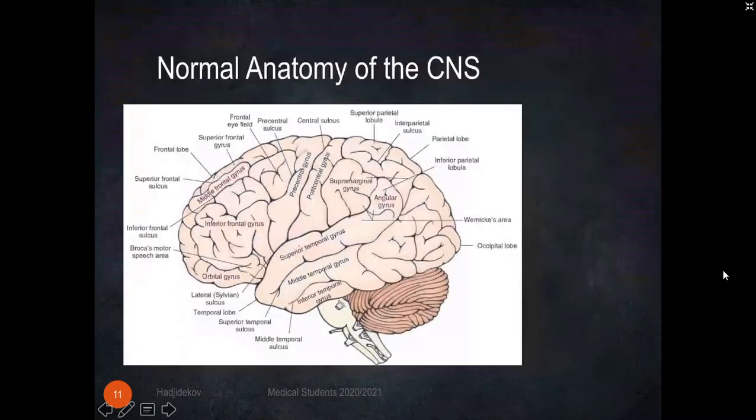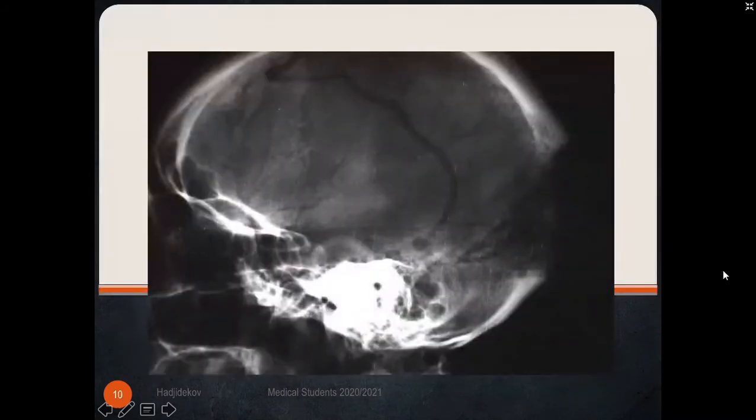I don't know exactly, because those are just some examples to tell you that if you don't have the medical history of the patient, you don't know exactly what you are observing. You are very limited with conventional X-ray, only to some traumatic changes, not more. But you always need to perform further CT or even MRI to give the final diagnosis.